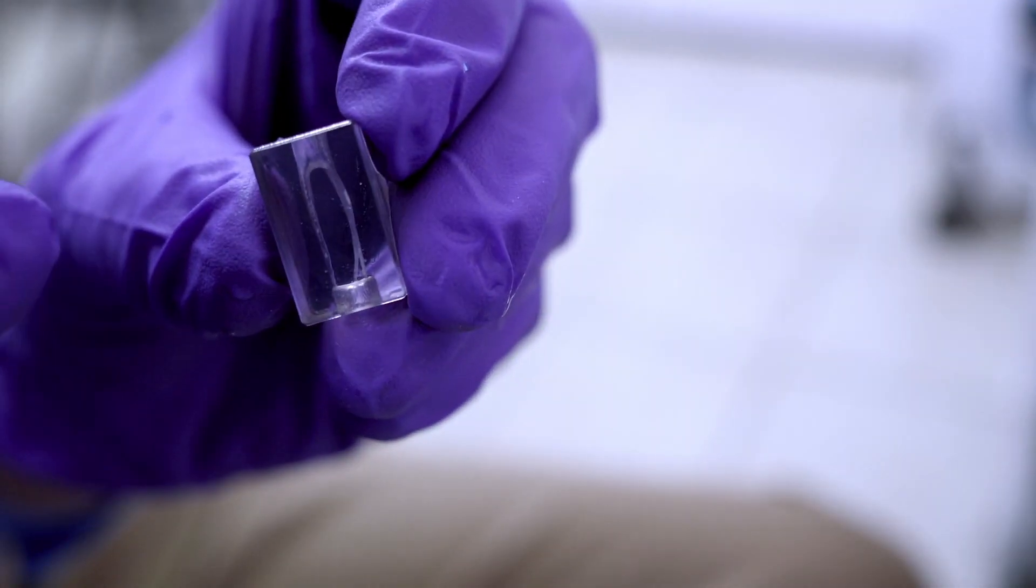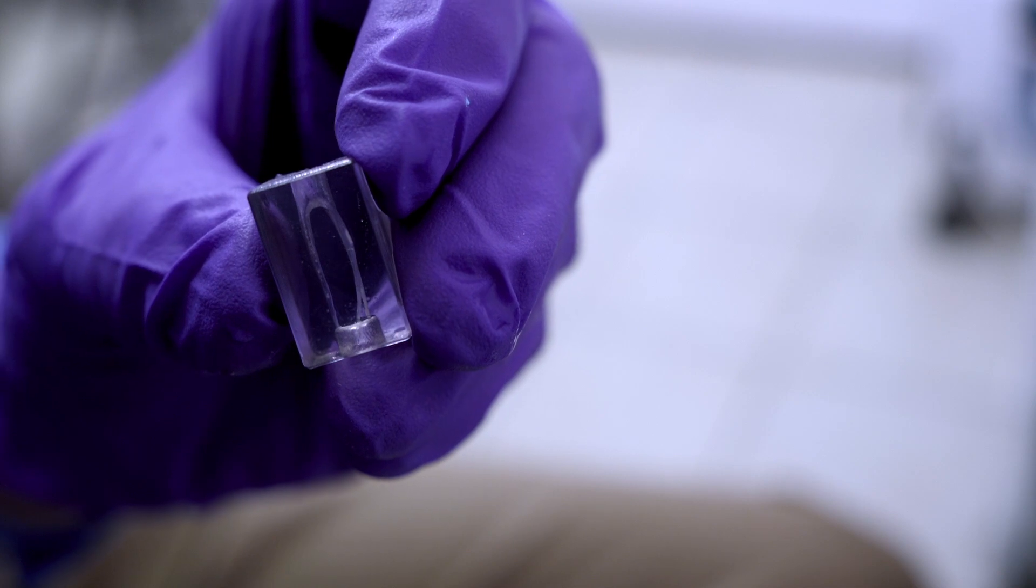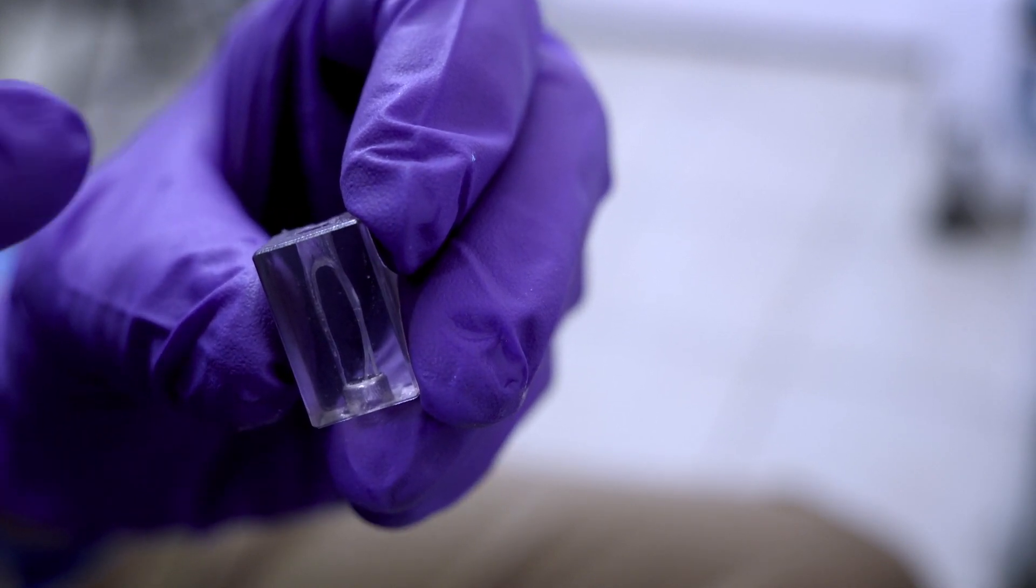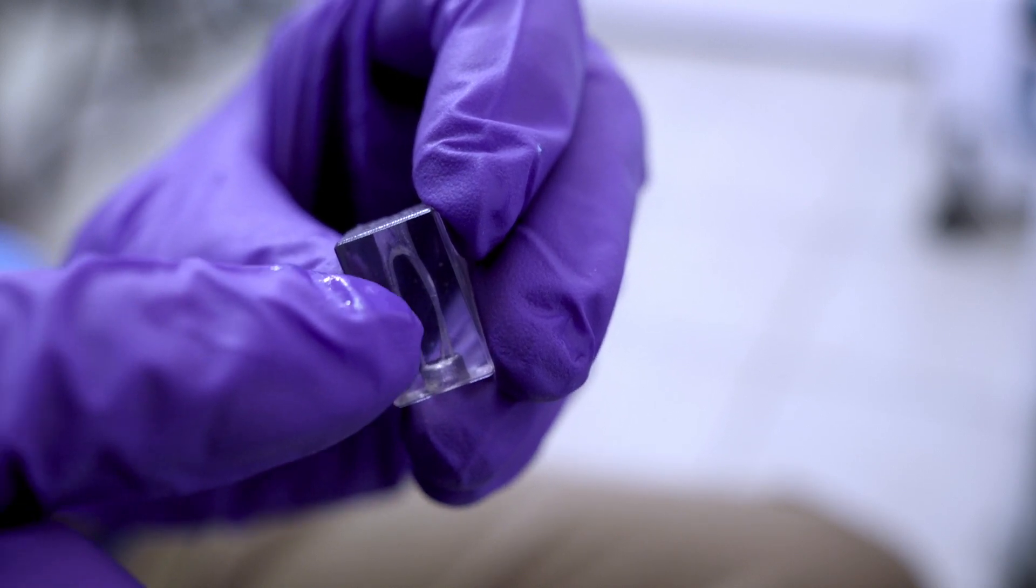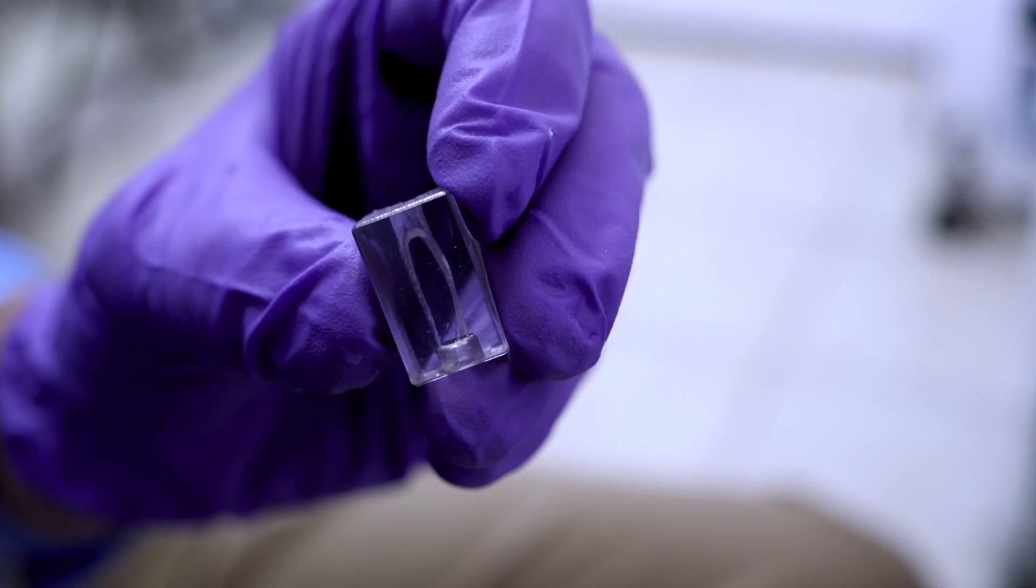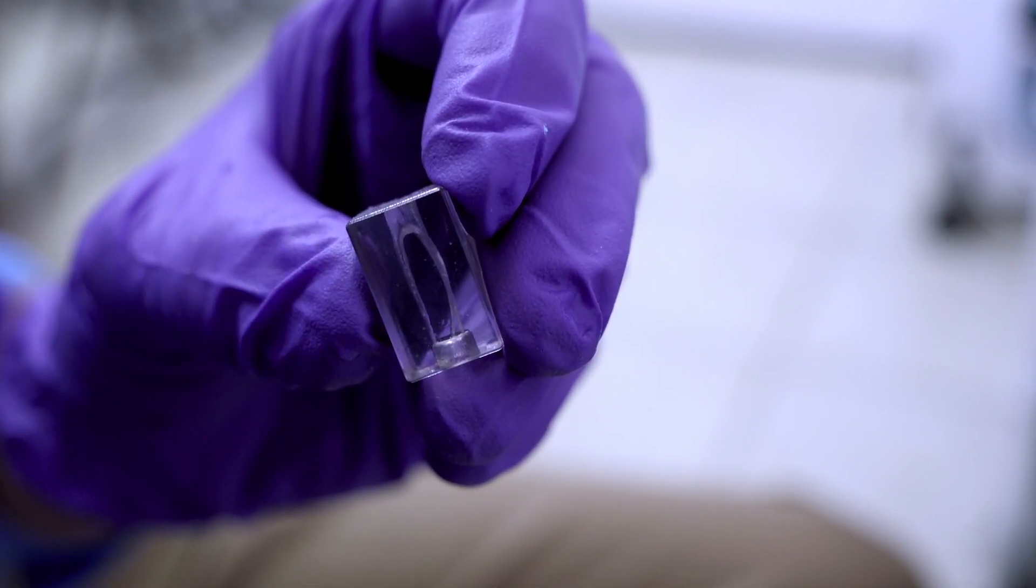After just 20 seconds with the Photona laser in sweeps mode, as you saw, the laser is on top of the tooth. And there's barely any more cement or white film in these canals.